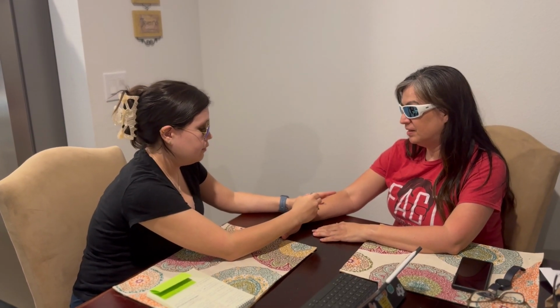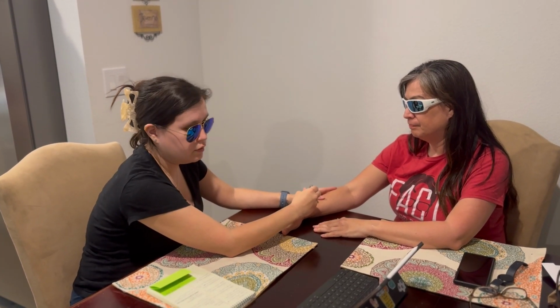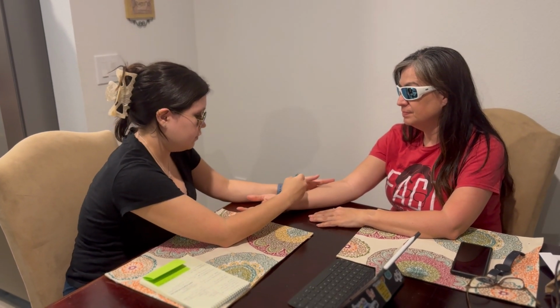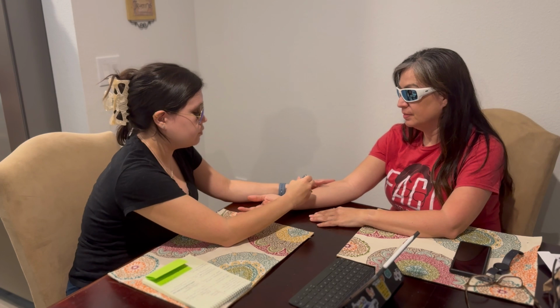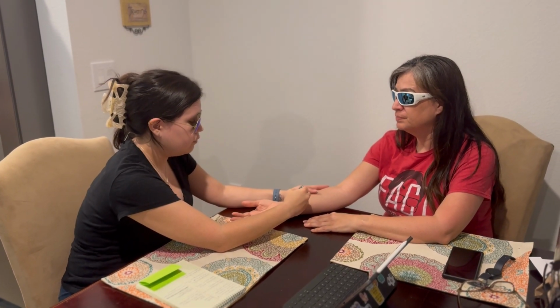Still doing okay? No issues, no pain? No pain at all. I can feel a little warmth, but it doesn't feel bad. It feels good. Okay, perfect. Okay, so I'm going to go ahead and rotate your arm so we can get the bottom side of your wrist. And I'm just going to keep doing those sweeping motions. And like I said, if anything starts to feel uncomfortable, just let me know. Okay.